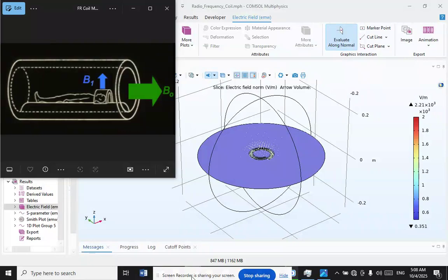As a patient is positioned in an MRI scanner, the tissue obtains a small magnetization M0 that aligns with the magnetic field. An RF transmit coil, or TX, generates an RF pulse that produces a small magnetic field perpendicular to the main magnetic field, which rotates the net magnetization away from its alignment with the main magnetic field.